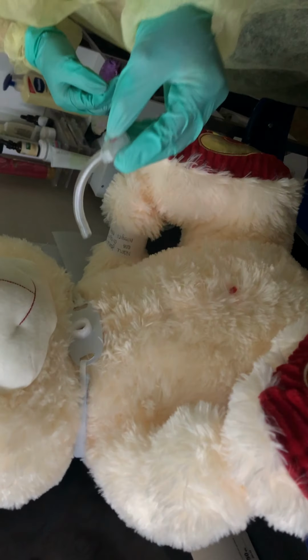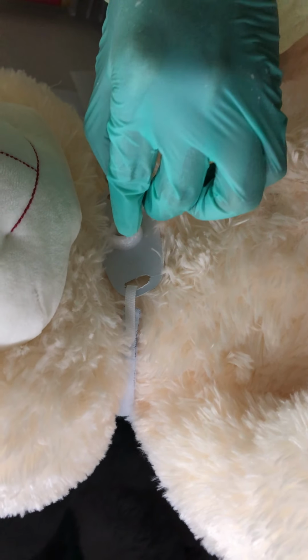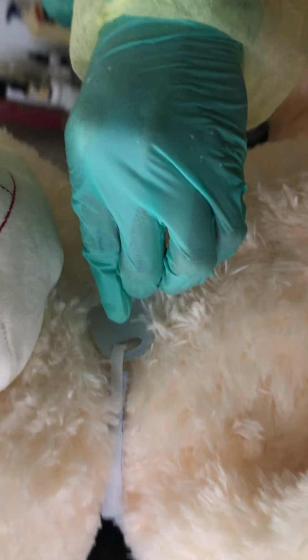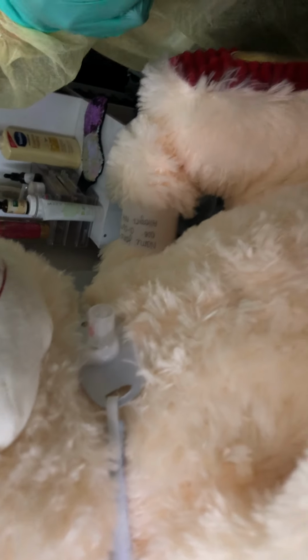And now I'm going to go ahead and grab my trach tube. Sterilely touch it, do not break sterile field. And I'm going to go ahead and insert my trach tube to put it inside. And I'm going to turn it to the right to lock it. It's locked. And lastly, at this point, my sterile procedure is semi-complete.